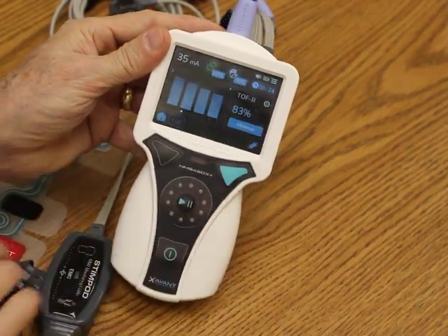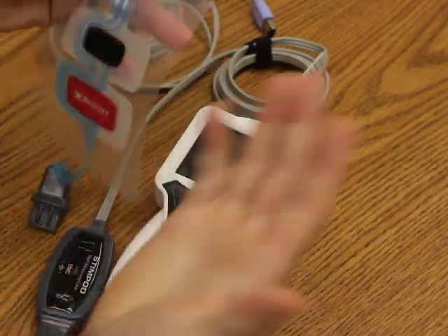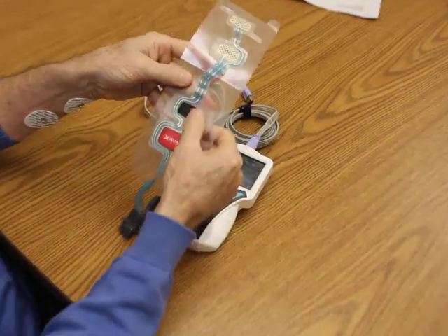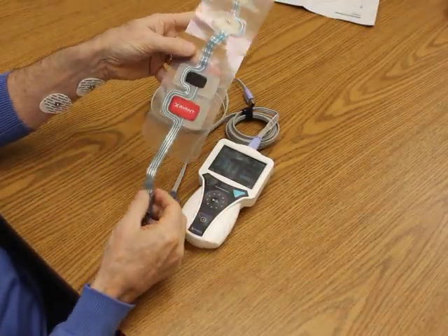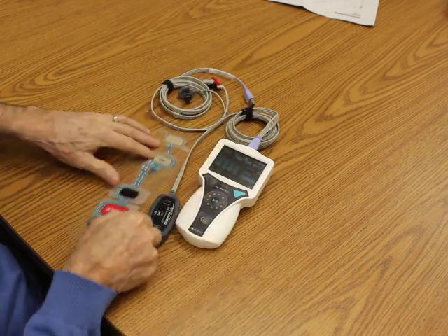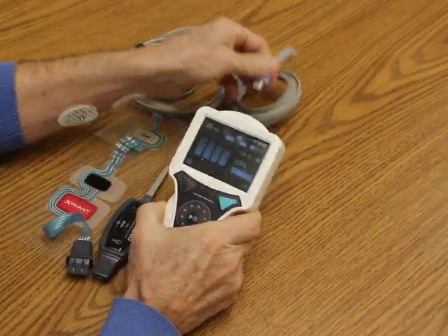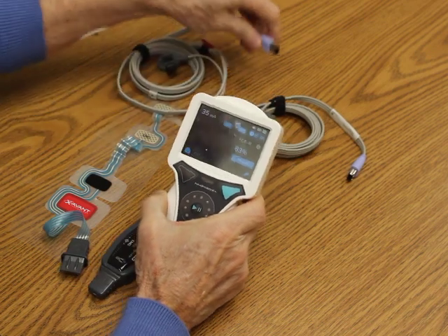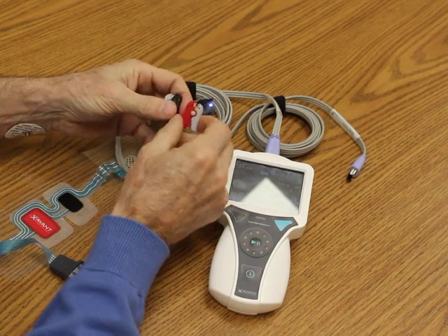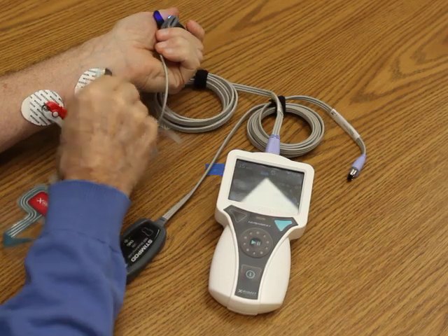So that's EMG under simulation. We use a sensor that is very well designed for both a left-handed or a right-handed patient. We have accordion areas and electrodes, and then an extra-long connecting point that connects to our EMG electrode. If I disconnect it, I'm now going to show you how it would work with our AMG sensor or acceleromyography. We are the only device available that can do both EMG and AMG in the same device.